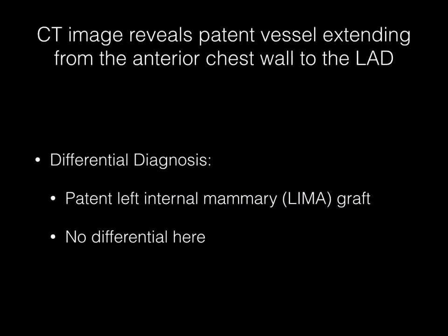This image from a CT angiogram of the coronary arteries demonstrates a patent vessel extending from the anterior chest wall to the LAD. This is a typical appearance for a patent left internal mammary graft in a patient who has undergone CABG.